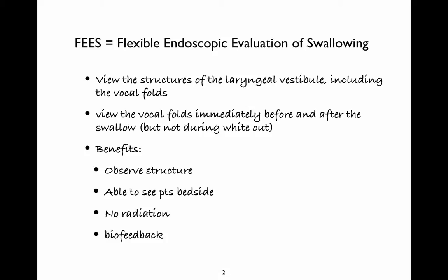Let's talk about why FEES is a useful methodology for evaluating swallowing. Well, you can observe the vocal folds directly, so you don't have to look at a lateral or an AP view and try to infer what the vocal folds are doing. You can see what they're doing.